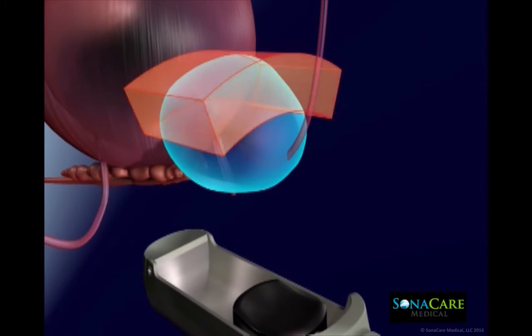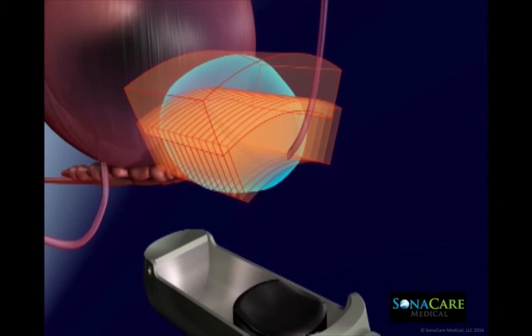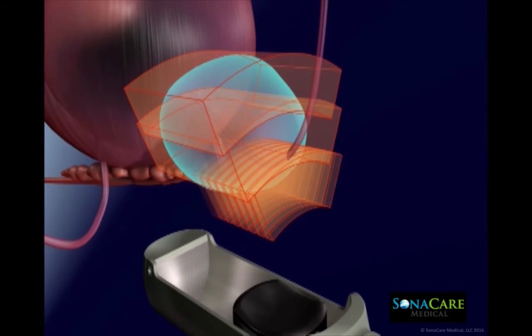The device makes use of integrated biplanar ultrasound imaging for real-time ablation planning, monitoring, and post-ablation imaging.